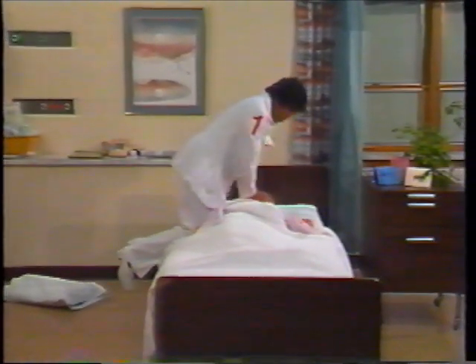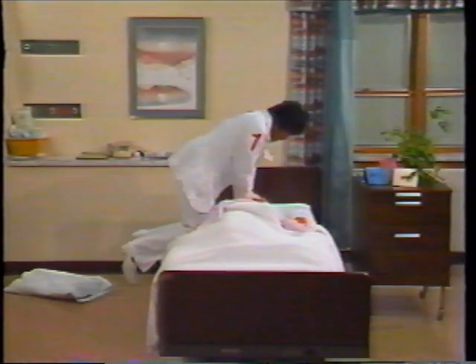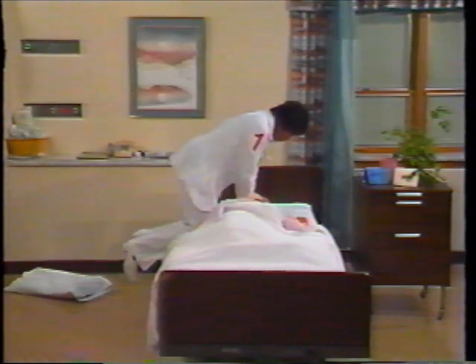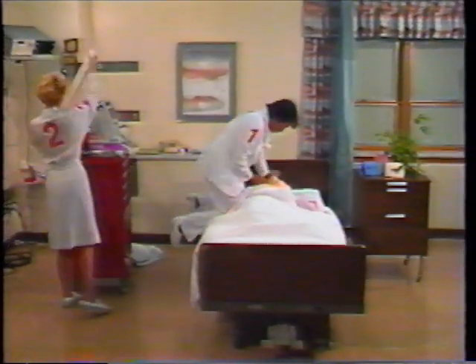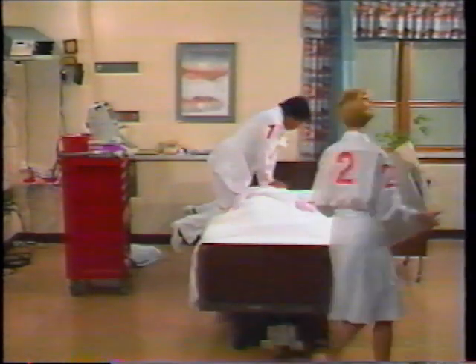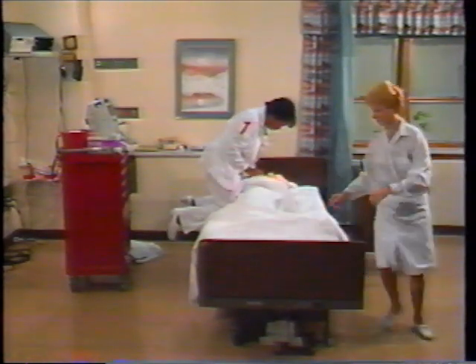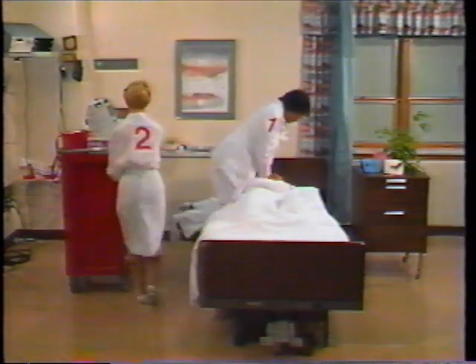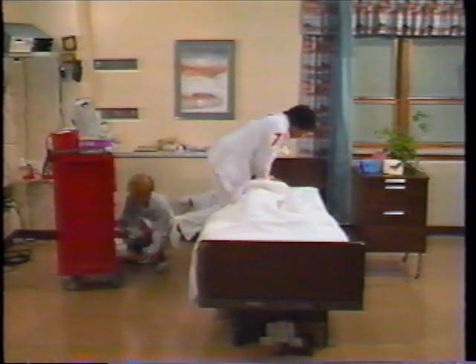1, 2, 3, 4, 5. Did you call code? All right, I'll get the card. 1, 2, 3, 4, 5. Have to put this under her? I heard the code.